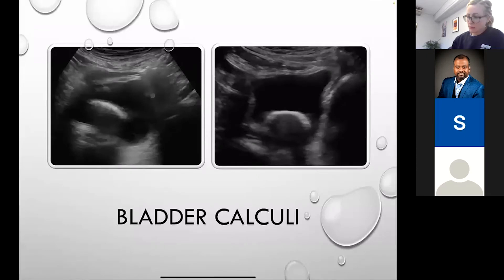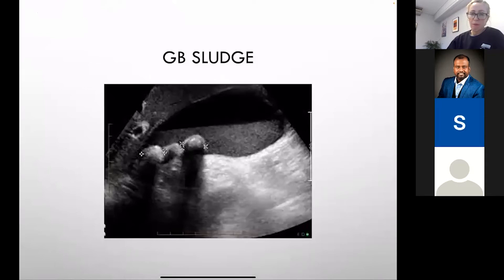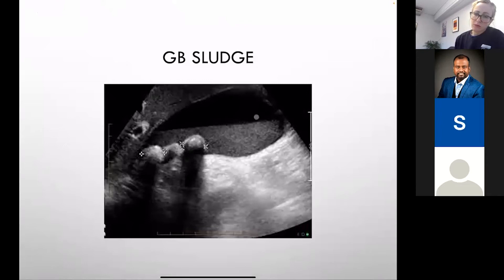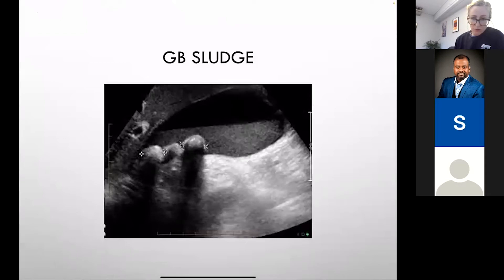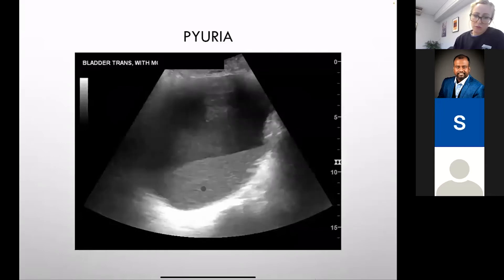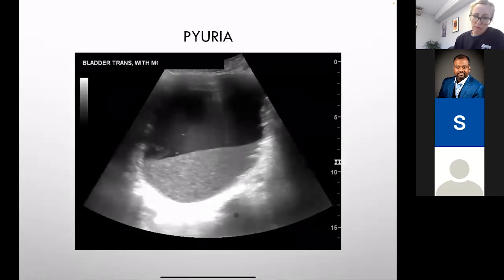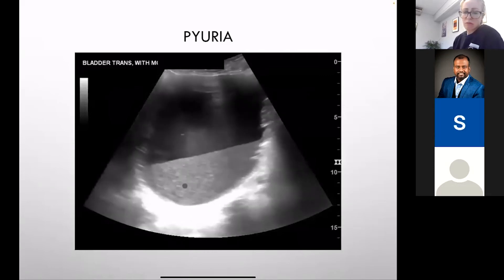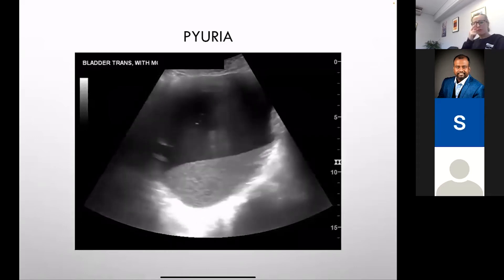Big stones in the bladder aren't that common. More commonly you'll see sludge and stones in the gallbladder — sludge is like sand and rocks. Sludge won't cast a shadow, whereas stones will because they're much denser. Similarly in the bladder, with significant UTI, pus, and inflammatory cells, you can see posterior acoustic enhancement. When you roll the patient, the sludge just slides away to the dependent part.